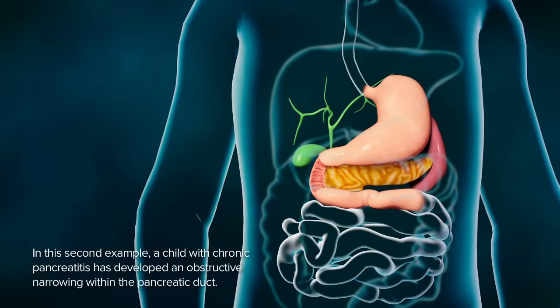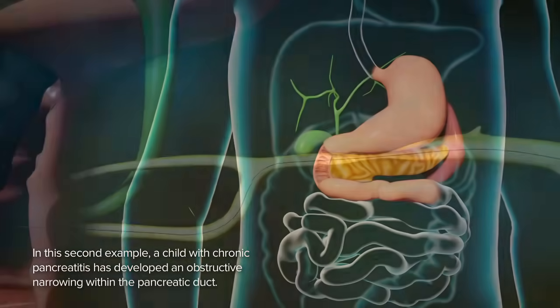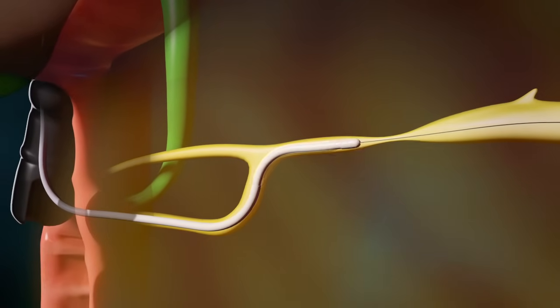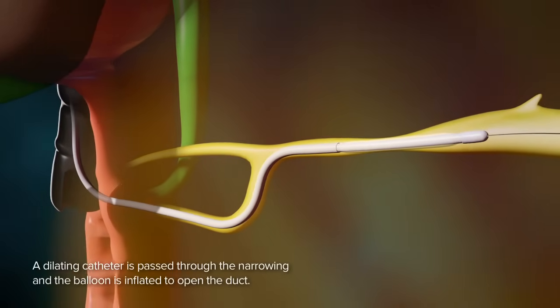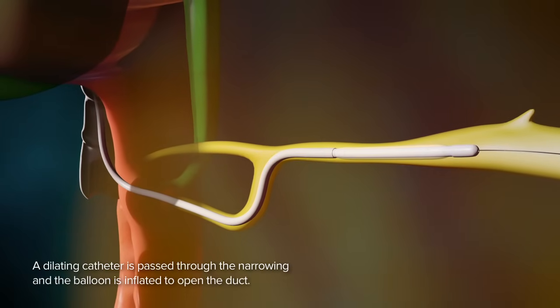In this second example, a child with chronic pancreatitis has developed an obstructive narrowing within the pancreatic duct. A dilating catheter is passed through the narrowing and the balloon is inflated to open up the duct.